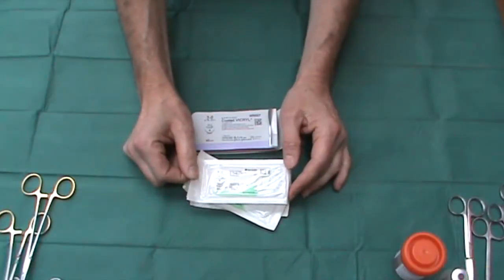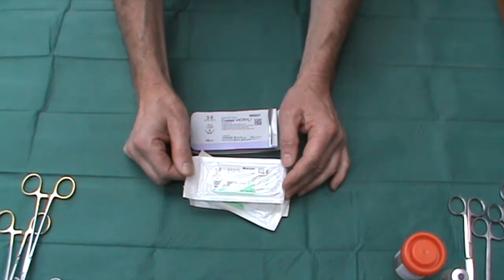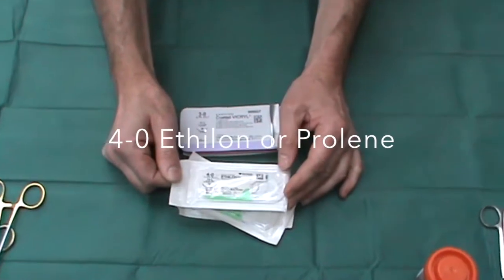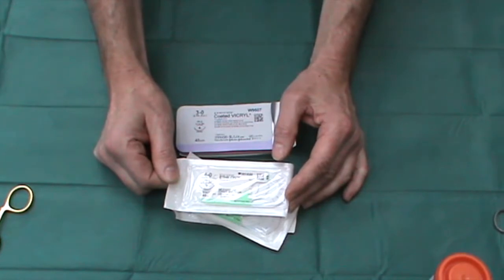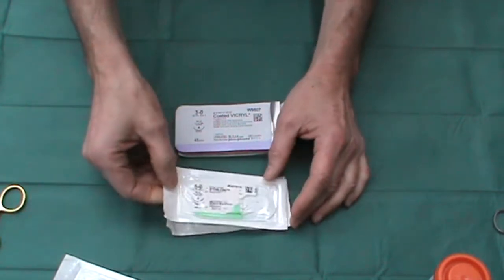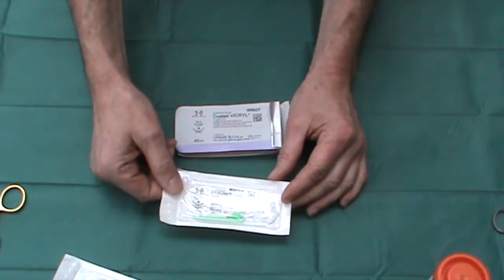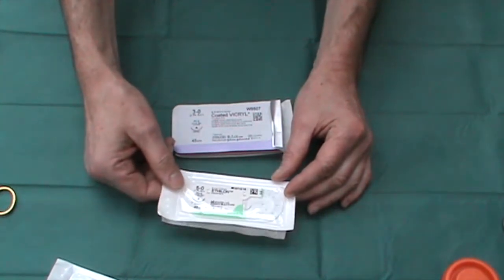When it comes to sutures, every surgeon tends to have their own favourite. For me, for skin and for non-absorbable sutures, it would be Ethylon. This is a 4-0 suture — I tend to use these on larger excisions, often back, abdomen, or lower leg. Although because I close nearly all of my wounds with deep absorbable sutures, if I did need to use skin sutures I might use something lighter, such as a 5-0 Ethylon.